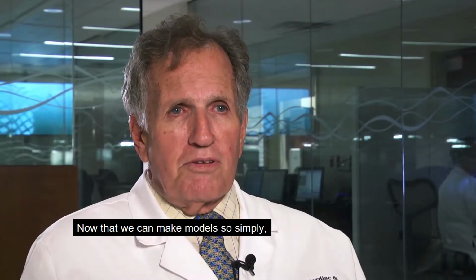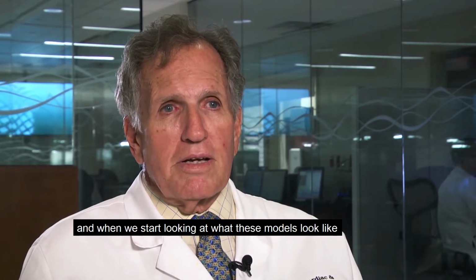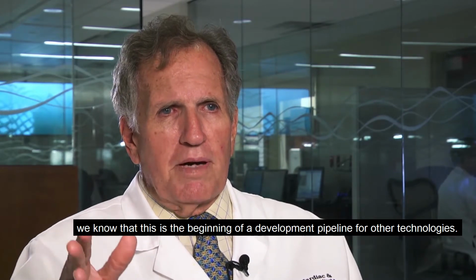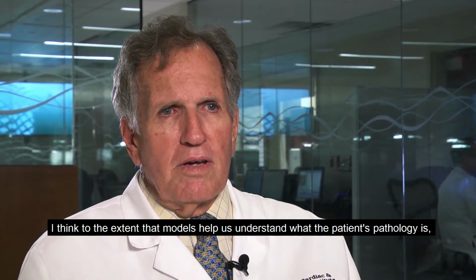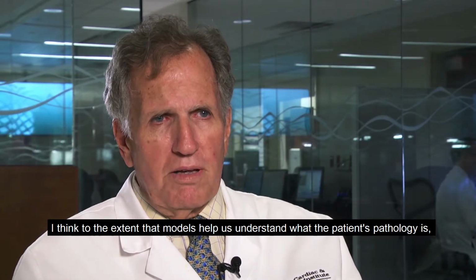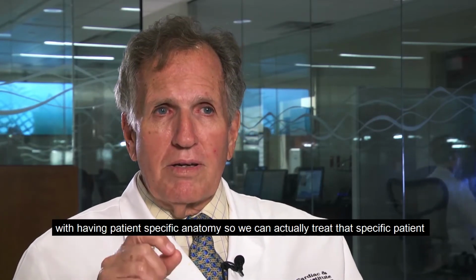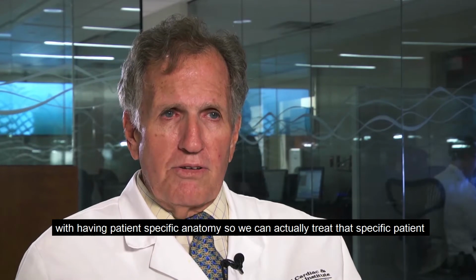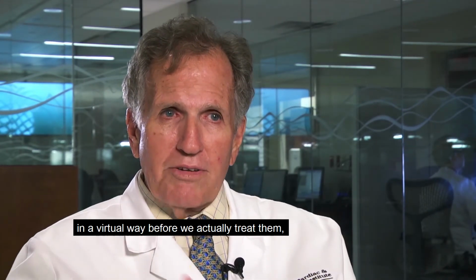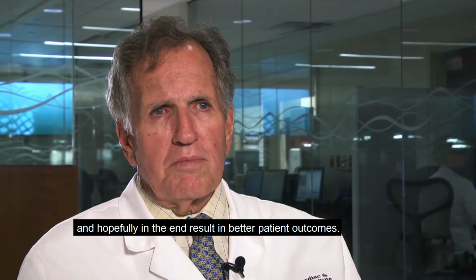Now that we can make models so simply, and when we start looking at what these models look like and see what they're like in the patient's hands, we know that this is the beginning of a development pipeline for other technologies. I think to the extent that models help us understand what the patient's pathology is, allow us to kind of run the racetrack before the race with having patient-specific anatomy, so we can actually treat that specific patient in a virtual way before we actually treat them, are going to make us all better practitioners and hopefully in the end result in better patient outcomes.